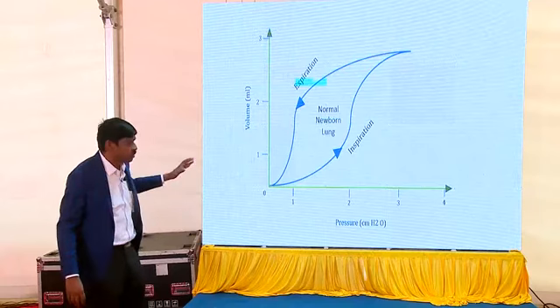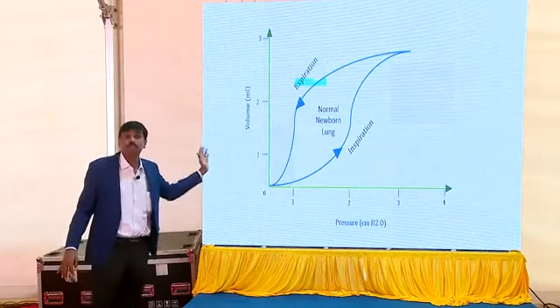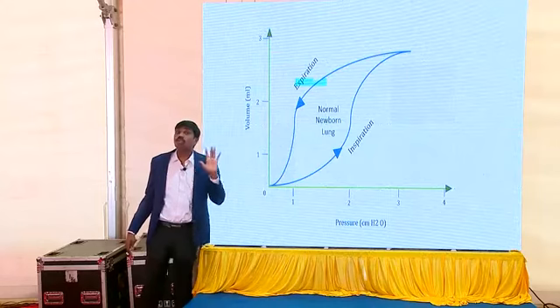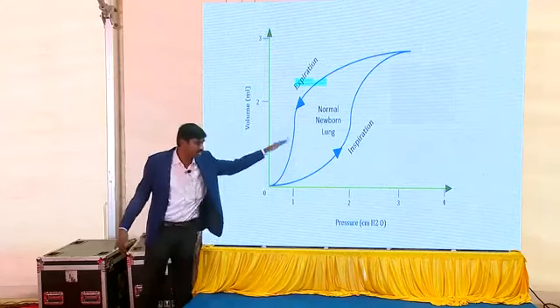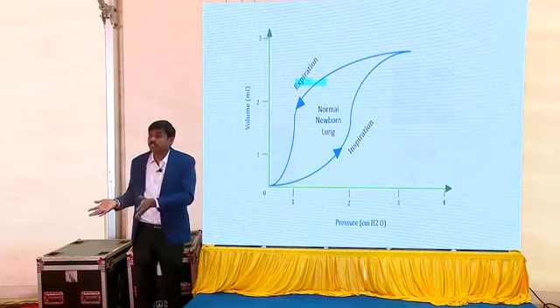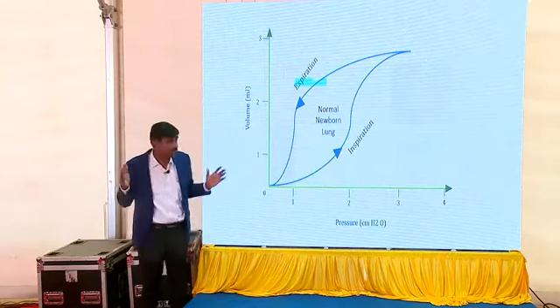Okay, we will have a separate section on pulmonary graphics too. Basically, whenever you're going to ventilate a lung, you always have to see this PV loop, or pressure volume loop. The slope of this curve will indicate how compliant your lung is. If this entire curve is lying down, sleeping, it means that your lung is very, very stiff. That's an indication that you either have to give surfactant, or you have to check something out. Now this one is standing. It means that your compliance is really, really good.